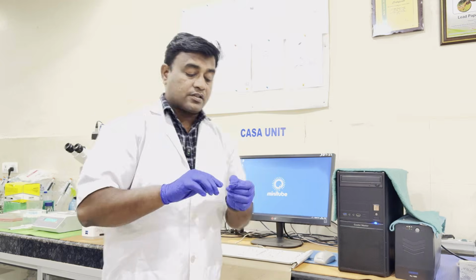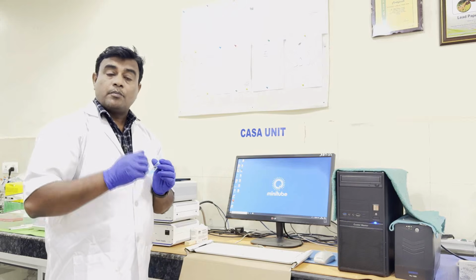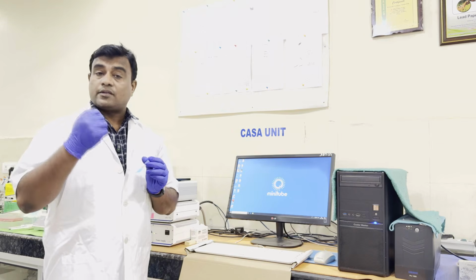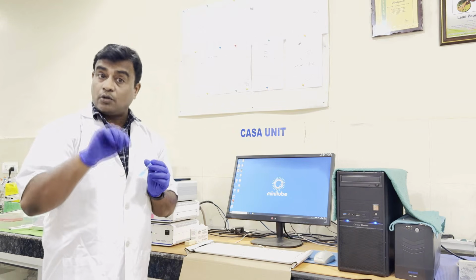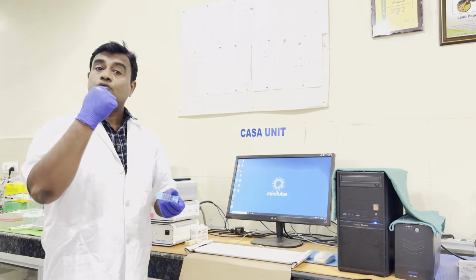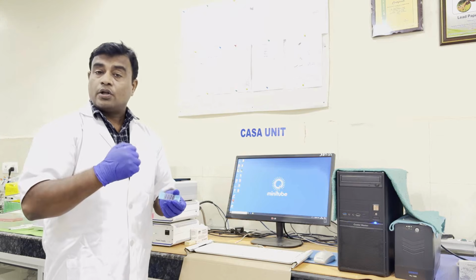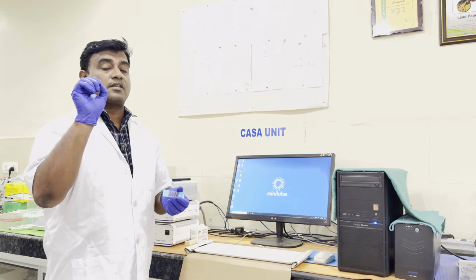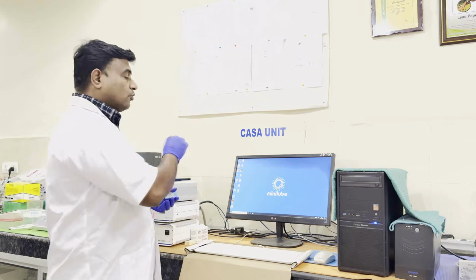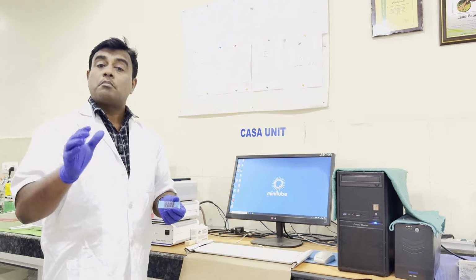Loading in these chamber slides plays a very important part of the semen analysis. Why am I saying this? Because when we go for pipetting of the semen, as you know semen is thick, and even though we have diluted it, there is still a possibility of small air bubbles. And when we load here, if you do not know how to load properly, there is a possibility of spaces. These spaces create a great problem when we adjust under the microscope.